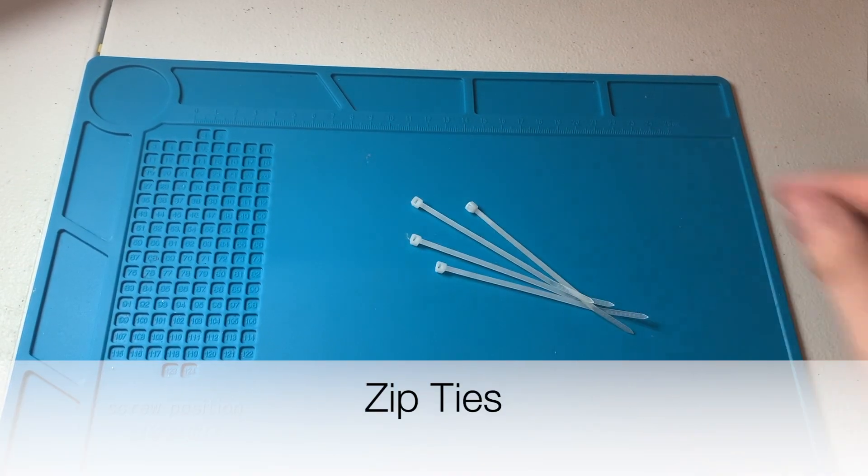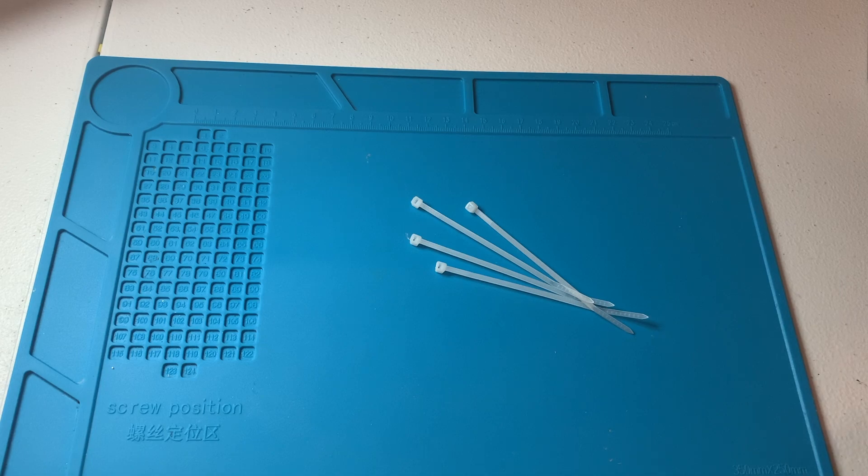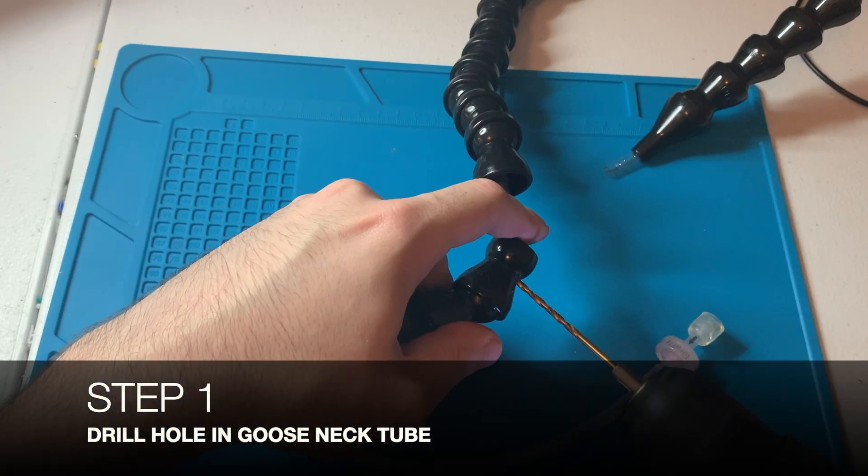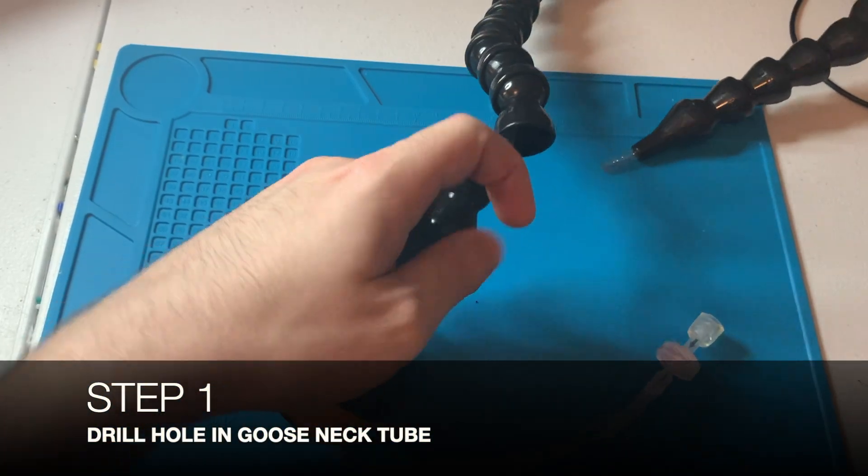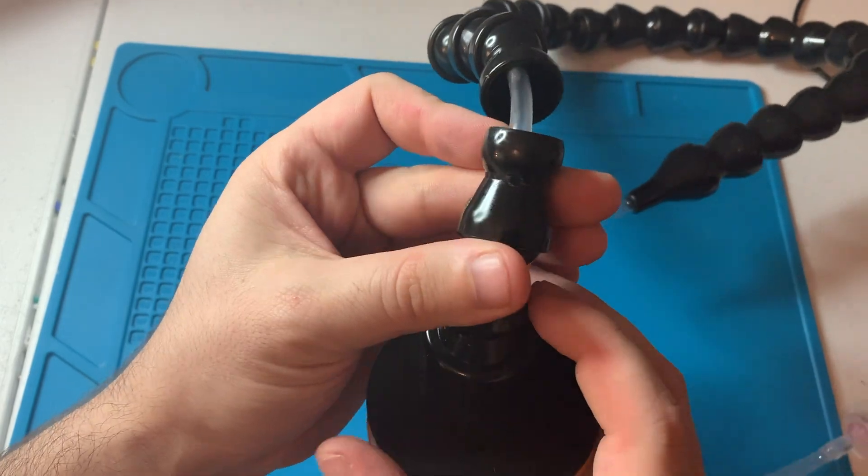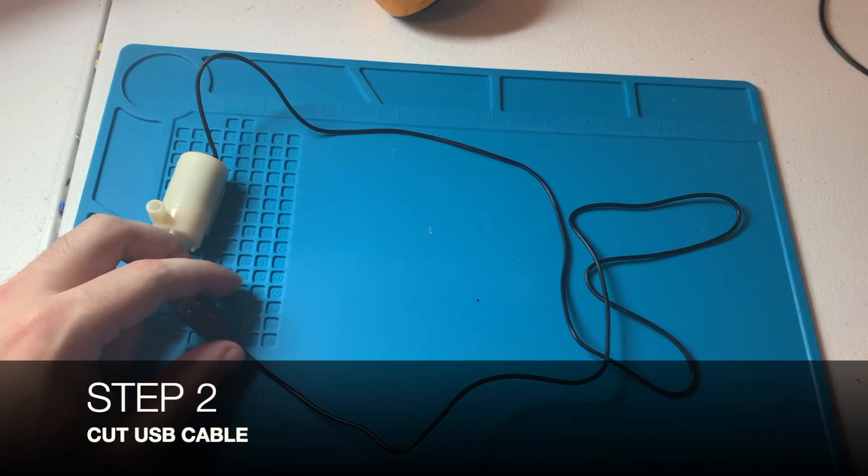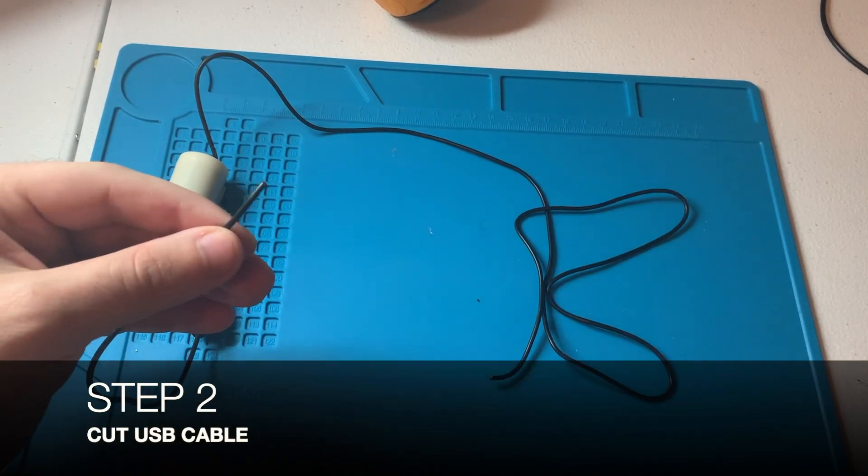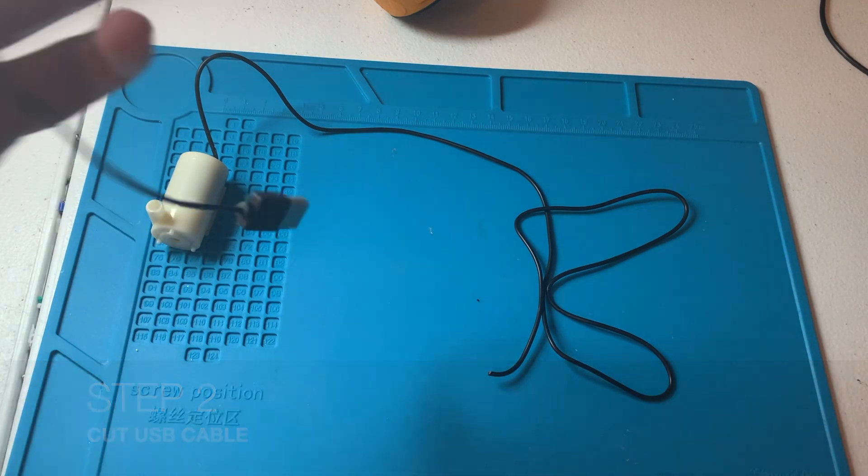The first thing you're going to do is take the water bottle gooseneck tube and drill a small hole after around three of these spaces. Then take your water pump and cut off the USB part.